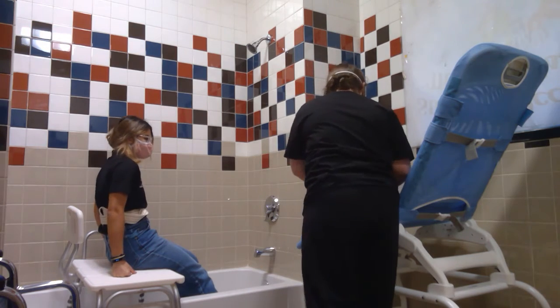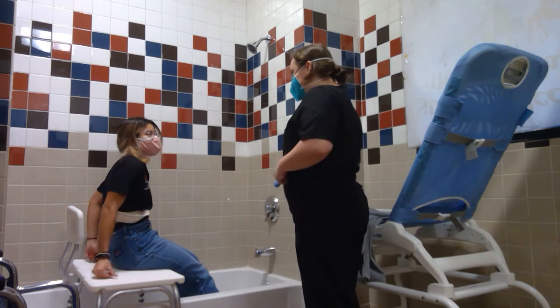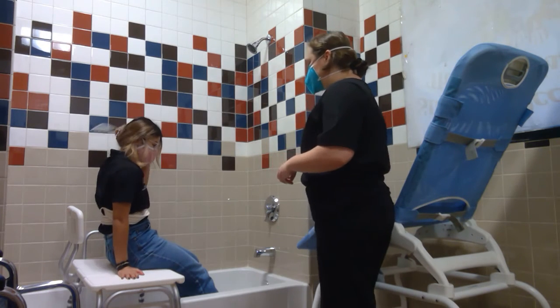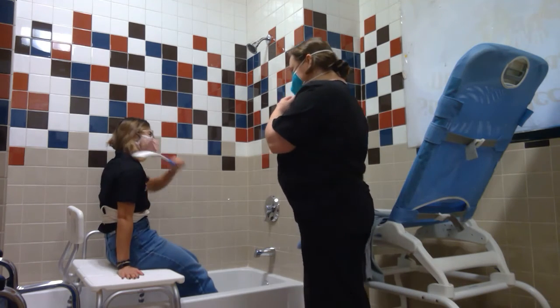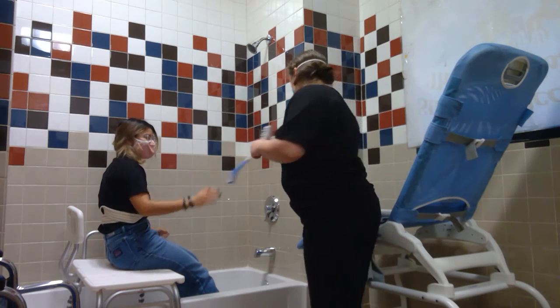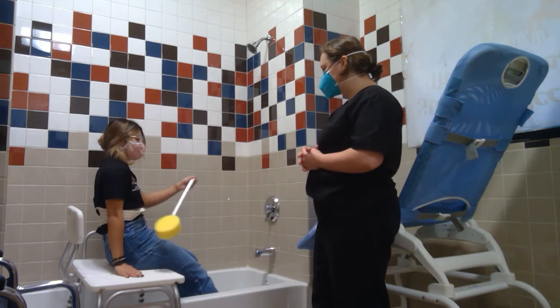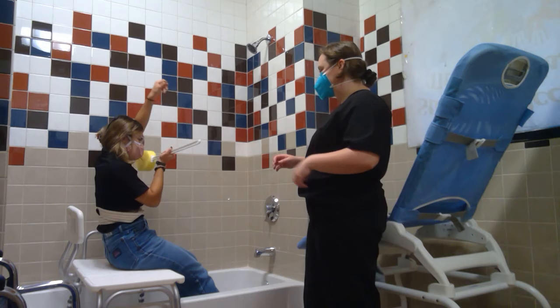All right, and so now we're just going to pretend like you're going to take a bath. And so, what would you do first whenever you take a bath? What do you usually do? Shampoo and then I like wash my body. Shampoo, wash your body. All right, so here's like your shower head. And I will get underneath. Right there. Great job. And so now when it's time to wash your body, this is great. I don't have to bend. Keeps your head nice and safe. So you don't have to worry about hurting it again, right? Yeah.